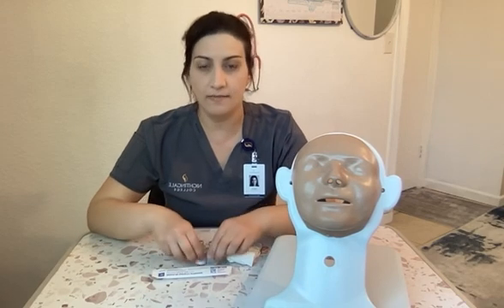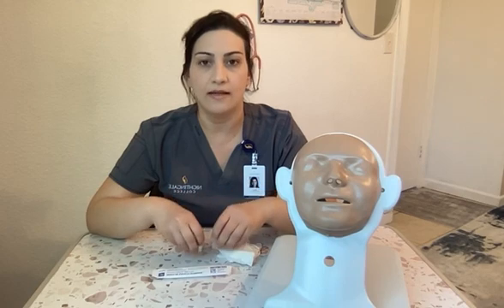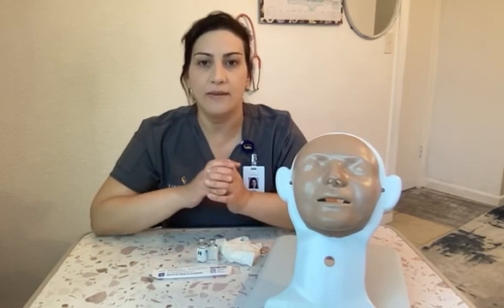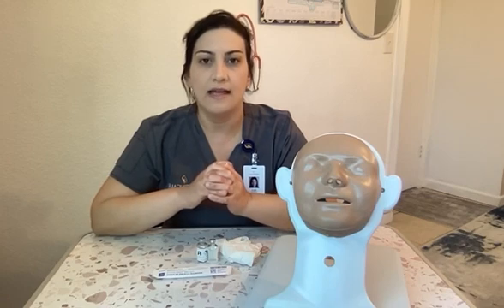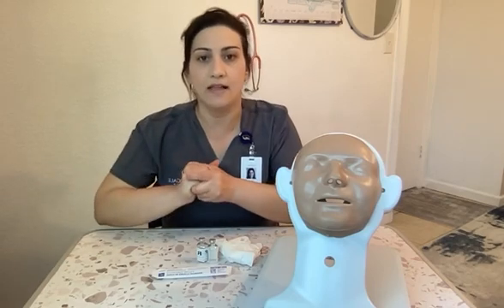Awesome. So this is going to be my 3rd and final time verifying against the MAR. At this point, I'm going to gather my patient's glucose levels and determine when the next meal is. And I will go ahead and perform hand hygiene here and don my clean gloves.